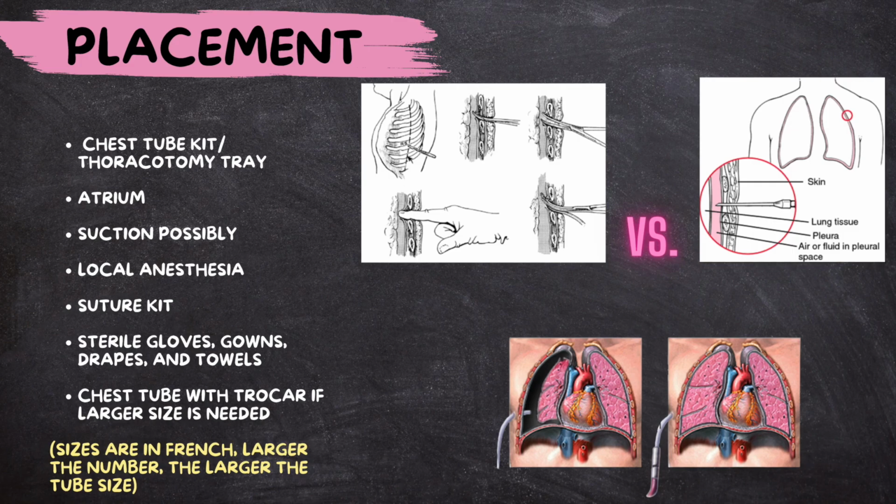Are we using a small tube or are we using a big tube? That's why I put two images here of what it takes to do both. Now this is not a super in-depth picture of both, and we're not going to go super in-depth on how the whole procedure goes, but I want you to know.